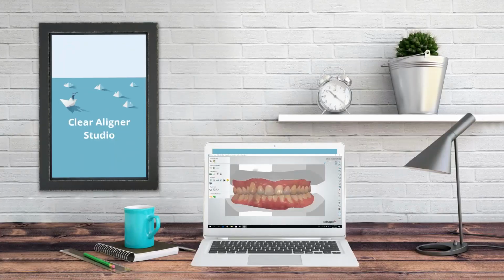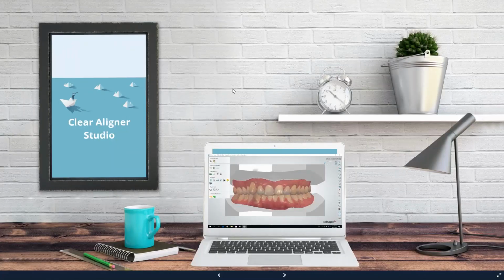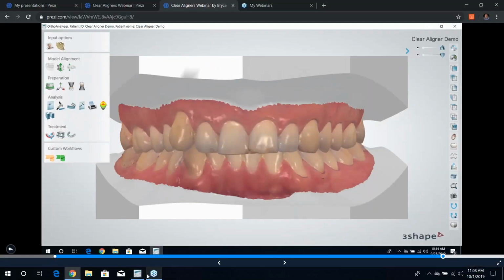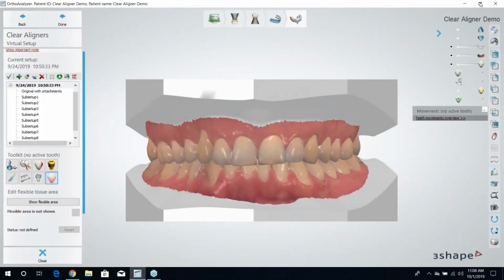So now I actually want to get into the software a little bit. So let's dive in. Downsize some things here. Okay. Also, I've got a little questions box here. If you guys have any questions at any point, feel free to type them in. I'll answer them as I can, if I can see them. I'm going to keep this little screen down in my corner here.